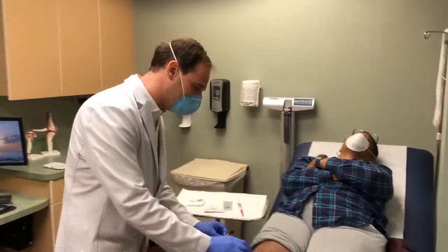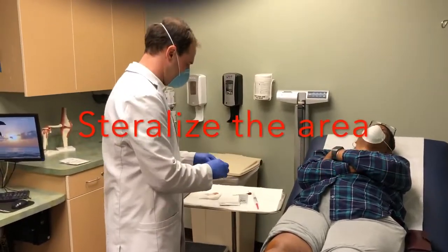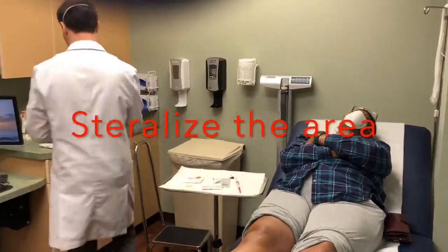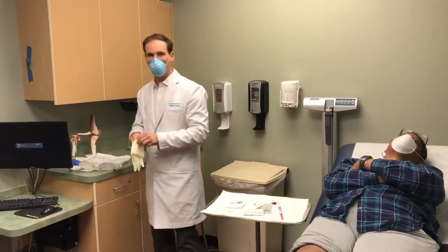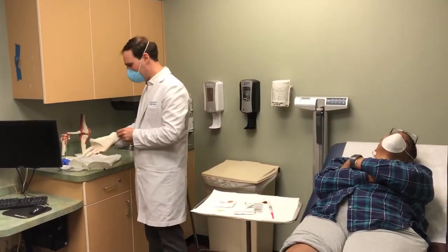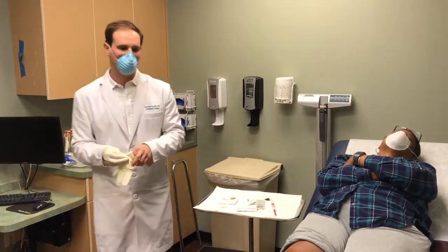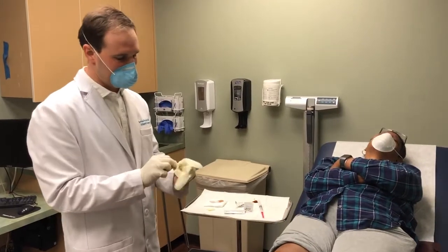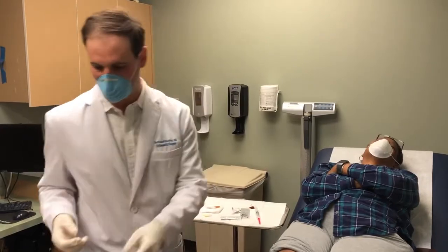To sterilize the area we first use a betadine swab. I put on sterile gloves because the biggest risk of this procedure is the possibility of bacteria getting into the joint, but by maintaining sterile technique you really avoid that issue.